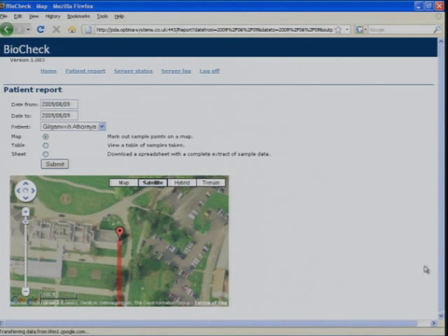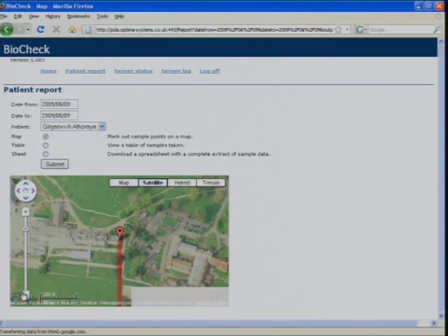So I've shown you an example of what you could do with Google Maps. It's quite straightforward to add markers in Google Maps, and as I have the GPS location, I can see where I am now. This is from last night, 1:15, and my heart rate was 67.98. You can't see that well, I guess, but if you hover over it, it will tell you some key data from that sample. I don't think that is secure. The alcohol level is kept secure. Published only for registered users.